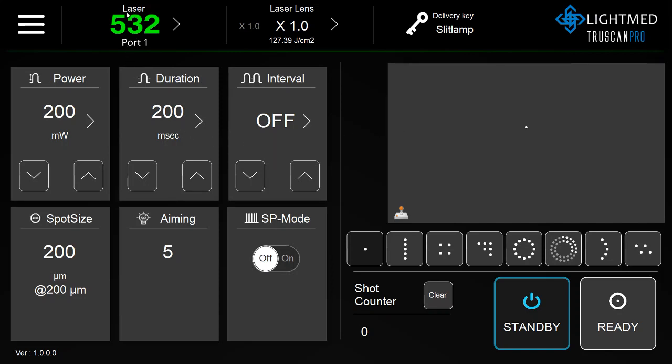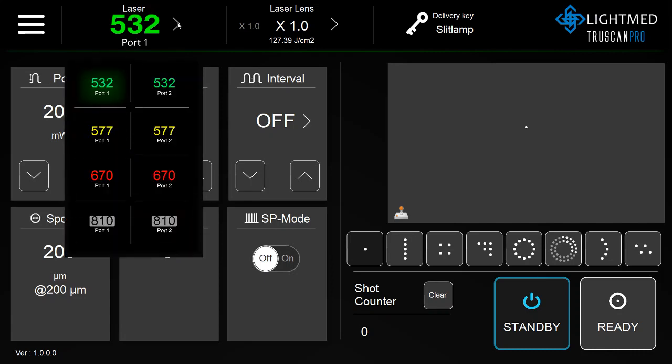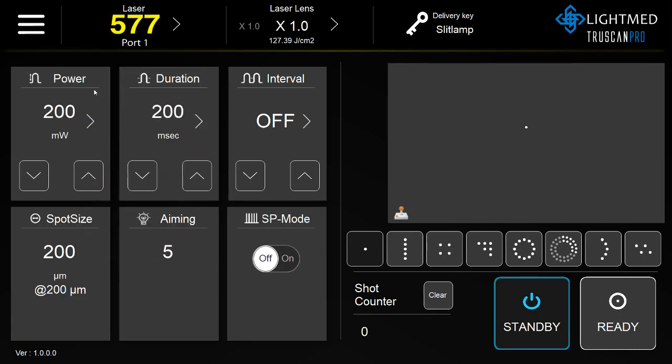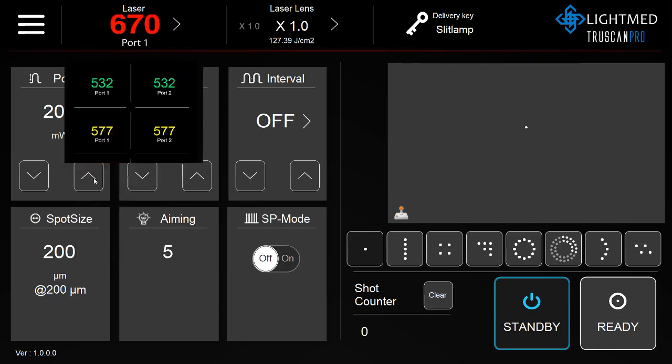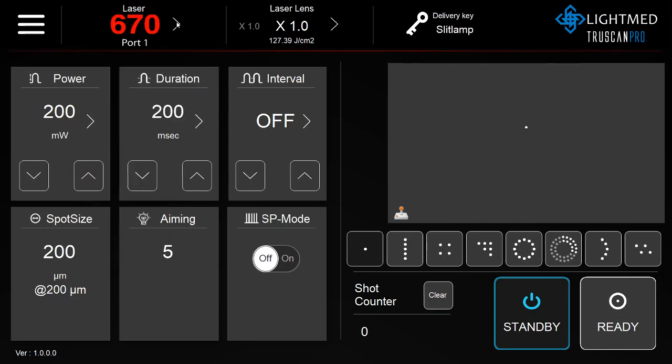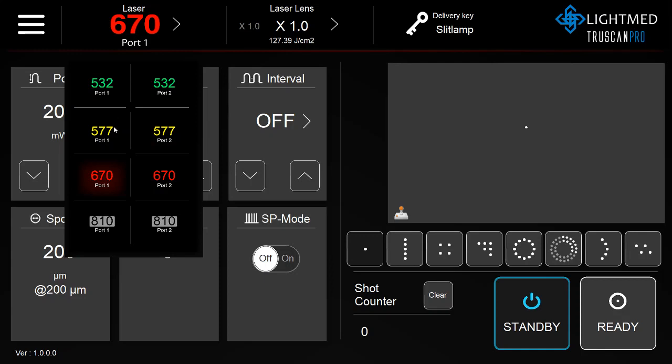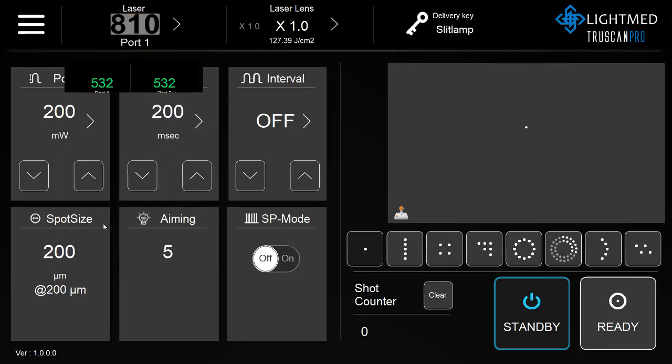In order to select the wavelength, click the right arrow, and you can choose between 532, 577, 670, and 810.